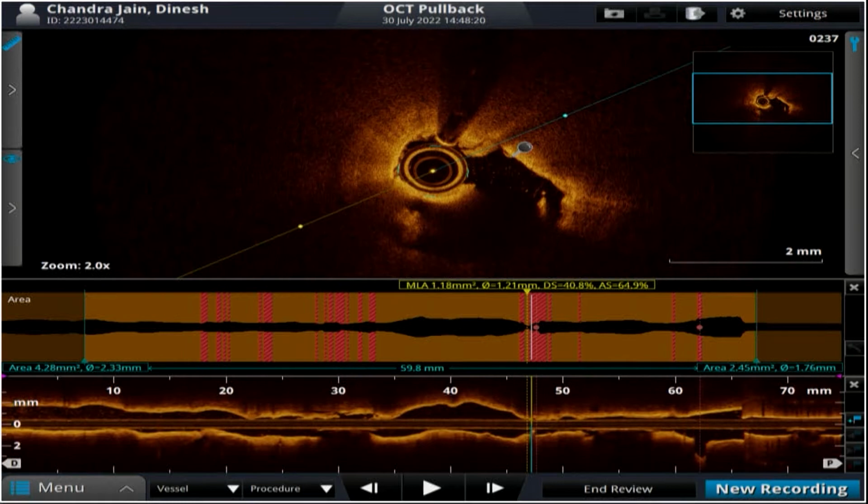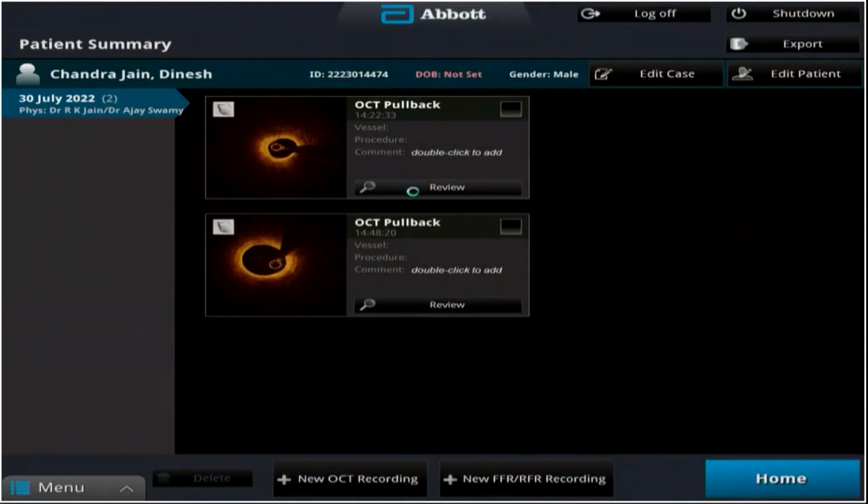So you start now with 2.75 distally, right? Right. Yeah, we'll start distally first. So the plan is to take a short 2.75 x 23. Do we need to overlap it with the other one, a 3.0 x 38 proximal? Let's work fast.